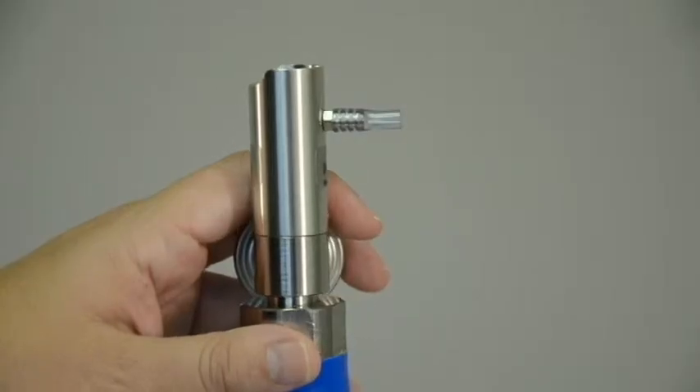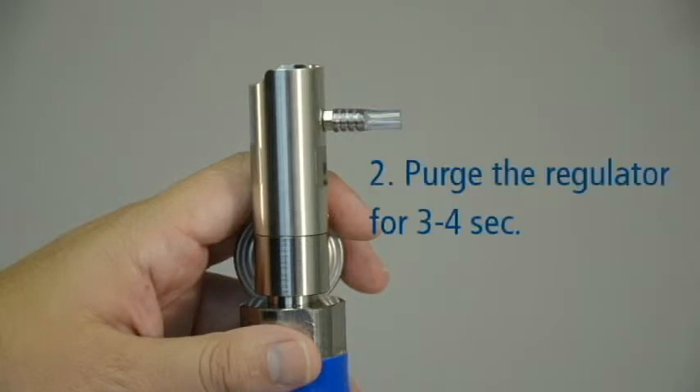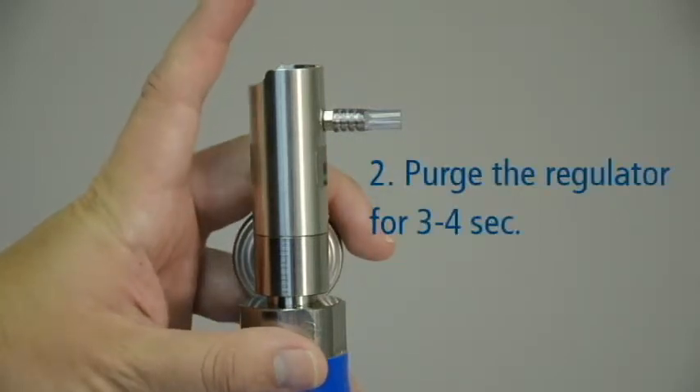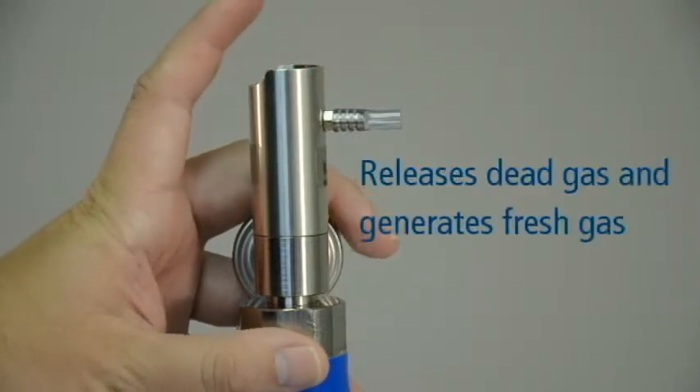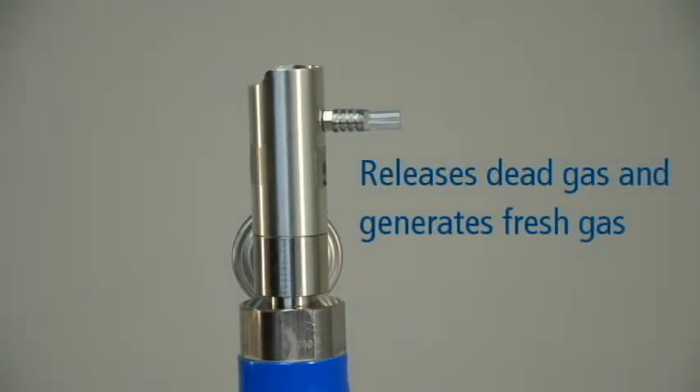Before performing the accuracy check, it is important to purge the regulator. This is done by pressing and holding the button or valve on the regulator for 3 to 4 seconds. Purging the regulator releases any dead gas that may be present in the regulator and generates fresh gas for the purpose of your accuracy check.